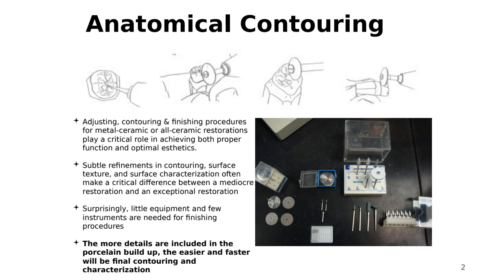Why? Because matching somebody's dentition is very hard in terms of the shade and the shape. Sometimes you look at the tooth and you see, oh my God, this tooth is a little bit crooked here. It's maybe a little bit rotated. That's the natural way, right? You want to copy that. But how do I make it look that way, but also be functional?